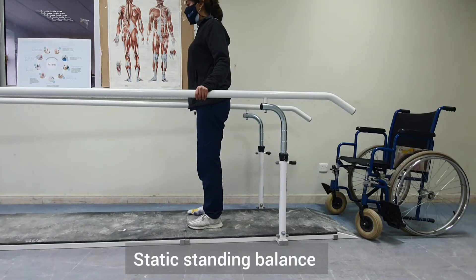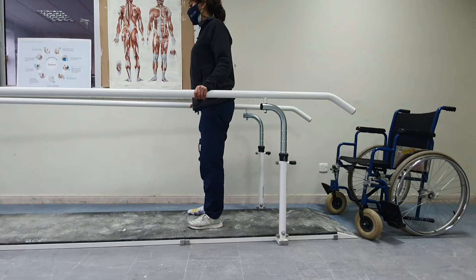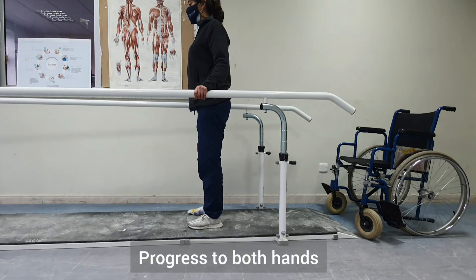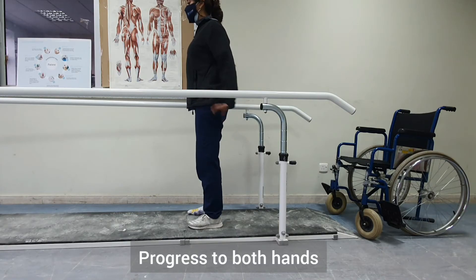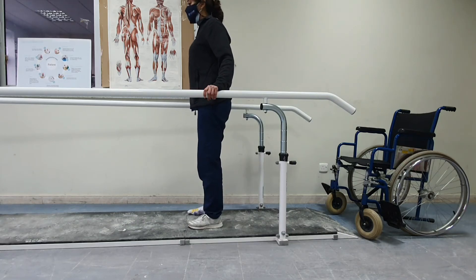We will start with static standing balance by teaching the patient to release one hand off the bar and move it back, then the other hand and move it back, and then to release both hands off the bars while maintaining their balance.